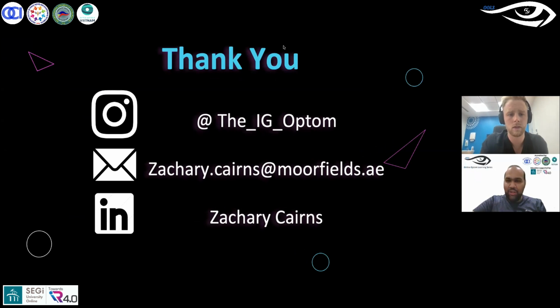Thank you so much, Zach, for that very informative sharing. I like your point about the retinoscope. That's the tool you need to have, and please use it. I agree. So many people have it and use it as a pen torch. It's so useful, and it's definitely a skill that even if you haven't used it in a few years from university, pick it up and start using it on patients.